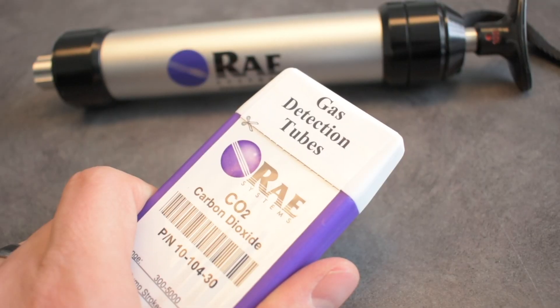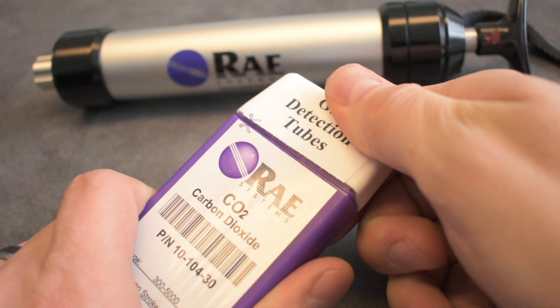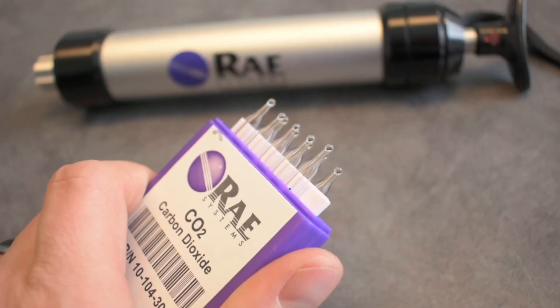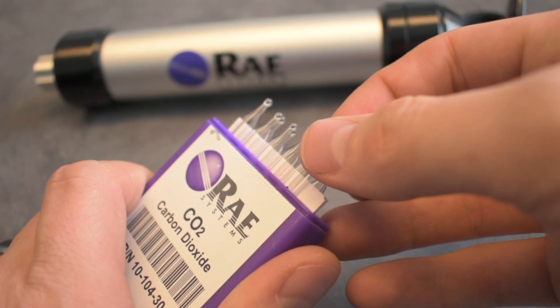First, gently open up the pack of tubes. You can cut along the perforated edge to make things easier. Pull out one of the tubes.